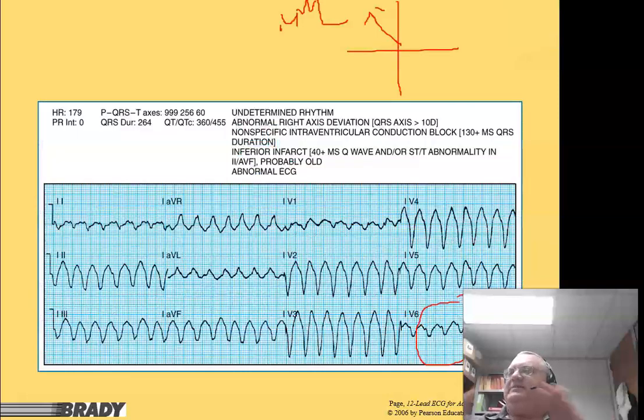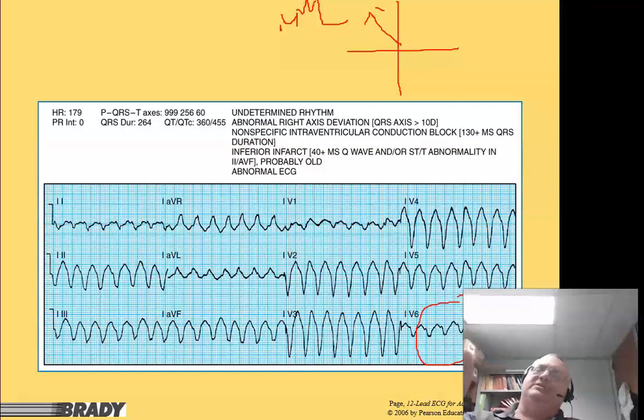Oh, I guess I should bring this up. So if they've got VTAC, again, our treatment for unstable patients is to cardiovert them. I will tell you that Page's stance on that is all VTACs get cardioverted, whether or not they're stable or unstable.